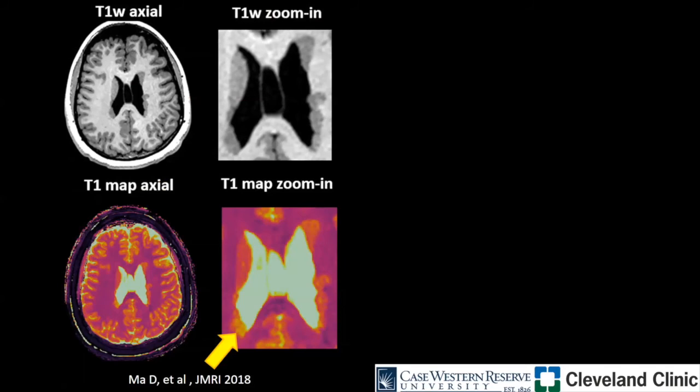So here I only want to show you some preliminary results to identify maybe promising directions of quantitative scan in disease detection and characterization. I've been working with Cleveland Clinic Epilepsy Center applying 3D MR fingerprinting for epilepsy patient scans. So this is one example of an epilepsy patient.